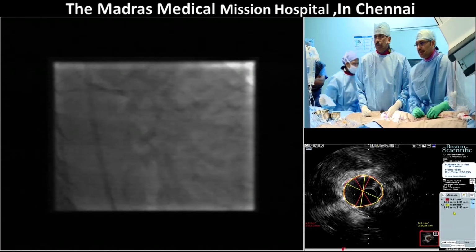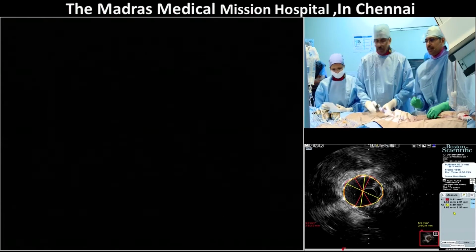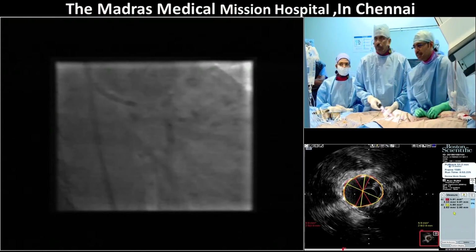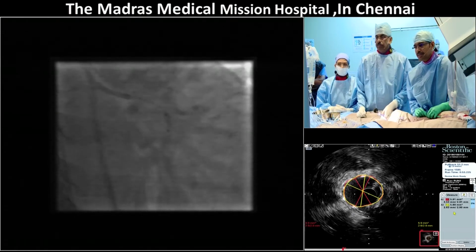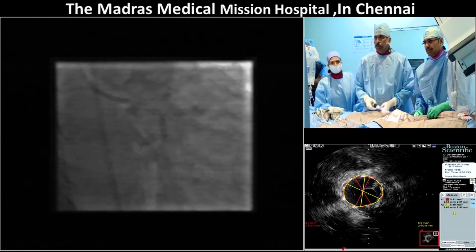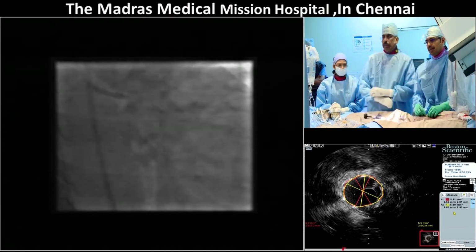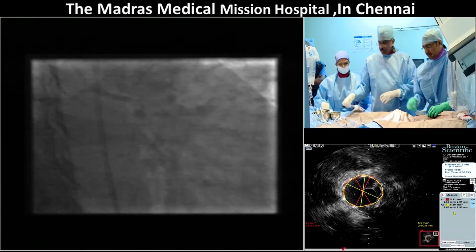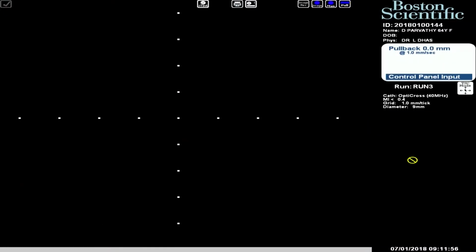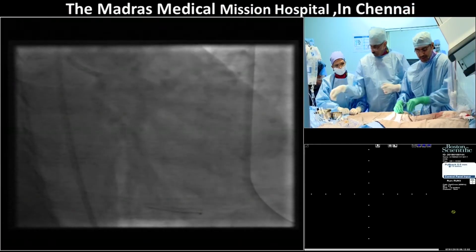Okay, so we're trying to position it right at the ostium. I'm just protruding it a little outside, and just going up to nominal pressures. I'll just come back a bit. In a second, just protruding it to correct the malposition. So we're just using nominal pressure, no high pressure, just to open that vessel up. That's enough, and that's what we've done. Can I get the IVUS here again? So it's a normal vessel with malposition, so you have to select a bigger balloon and go at nominal pressure. That is enough to correct the malposition. You don't have to apply high pressures.